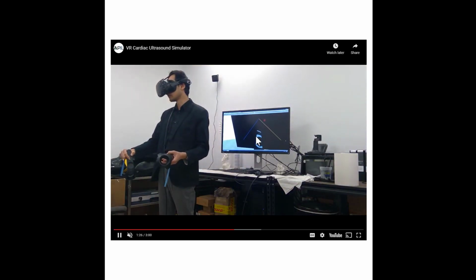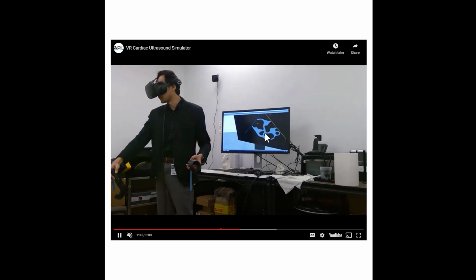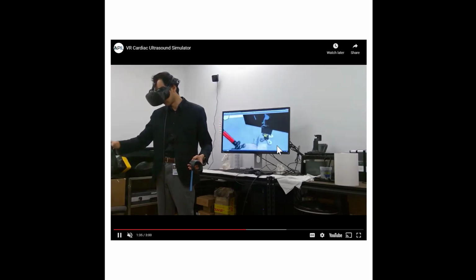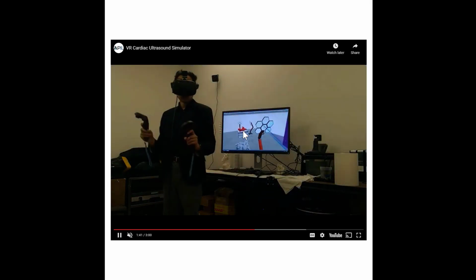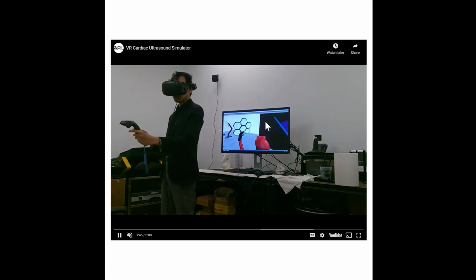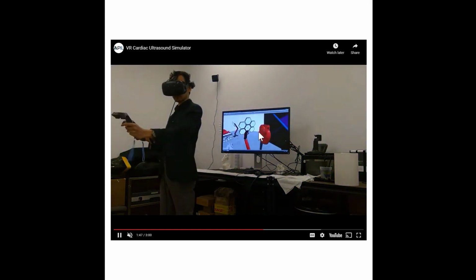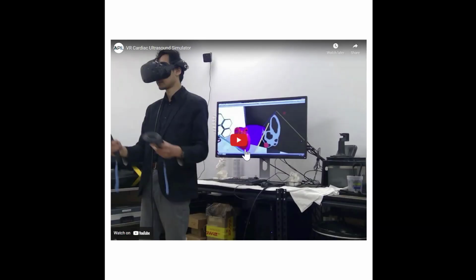Right now, they are looking at the chest that's in front of them in the virtual reality room. And as they scan across ribs, that's where we're seeing kind of the cutouts. You can see the chest on there when they look there. And as they turn the transducer, they get different views. They have other things that they can do in this room. This is actually set up as a surgery simulation, but it also uses echo to teach a little bit more about how the heart is set up as well.